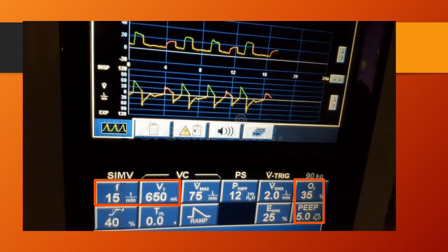So effectively, all you need to understand for SIMV versus AC, AC is more for people that need a little bit more support. SIMV is more for someone maybe who's ready to start doing some weaning from the ventilator. Simple as that. And as the nurse, that's all you have to understand. And keep in mind, every facility is different. Some hospitals, doctors are just going to prefer one mode. So you always are going to look at the picture as a whole. But if you had to break it down and really keep it simple, AC, more support. SIMV, more of a weaning mode.